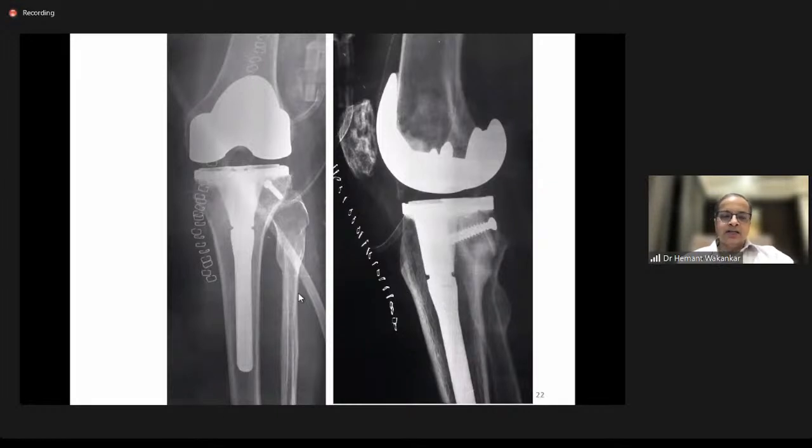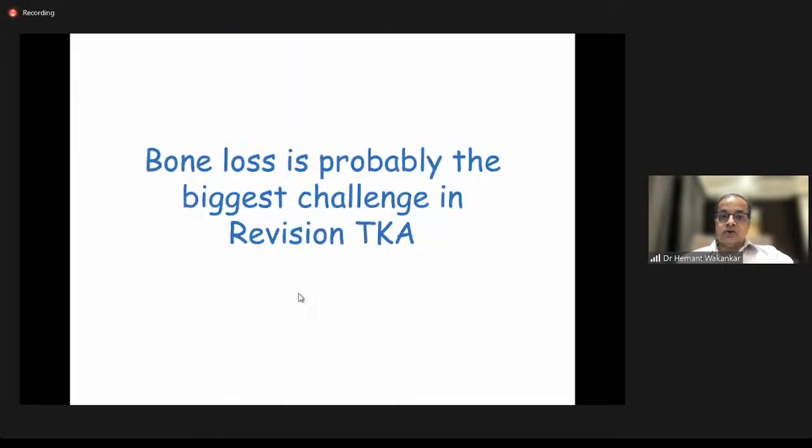And dissimilar metals should never come in contact because they cause galvanic corrosion. So the screw should never be touching the metal plate, the metal base plate. And that is true anywhere that you use them: dissimilar metals should never come in contact with each other. So that is to do with the primary.